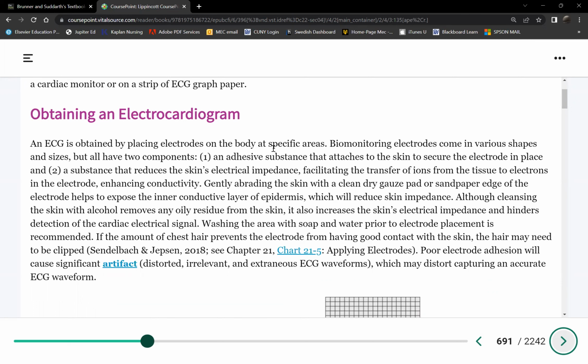Well, the telemetry, the cardiac monitor that you see, which has about 5 leads, 1 on each arm, 1 on each leg, and then 1 on the chest. So that's 5 electrodes, right? So therefore, that only gives you about 6 leads. It doesn't give you 12.